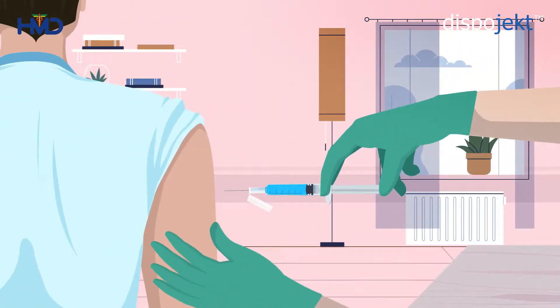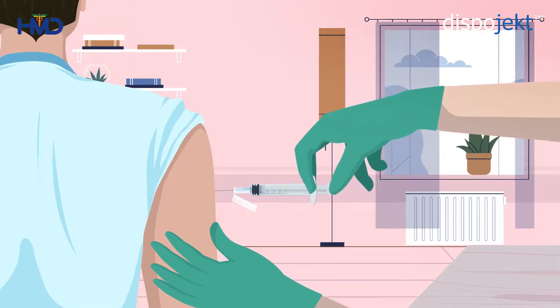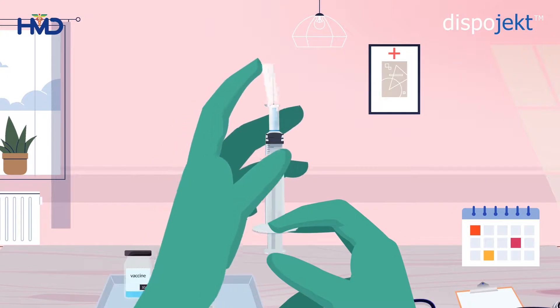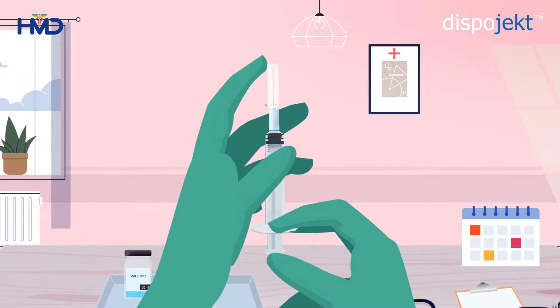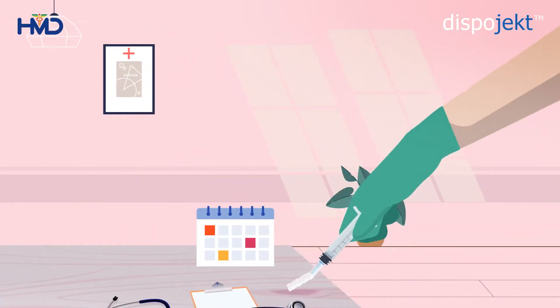Administer the injection to the patient with a one-hand technique and safely remove the needle from the skin. Flip the needle cover up immediately after use to cover the contaminated needle point. Now, press the needle cover against a hard surface — it will activate the locking mechanism. You will hear a click sound when the needle cover is locked.